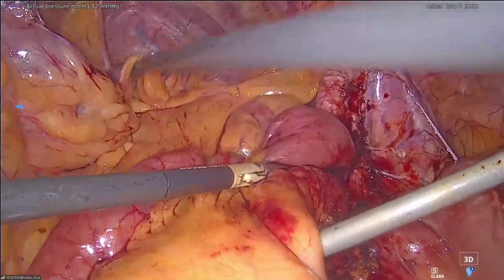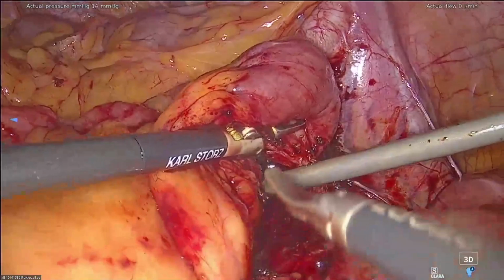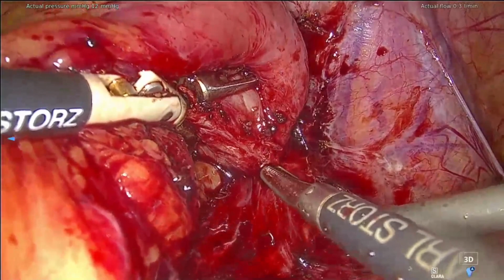We have already started to free it. Show me lower, here, release the suction. You can see suction here to clean. We have a very strong adherence, and it was adherent from here to there. We have already released a part, and I just want to finish releasing this one. Then I can, of course, enter inside the bowel or inside the iliac vessel. It can be both. If I can choose, I prefer the bowel, but sometimes we cannot choose.